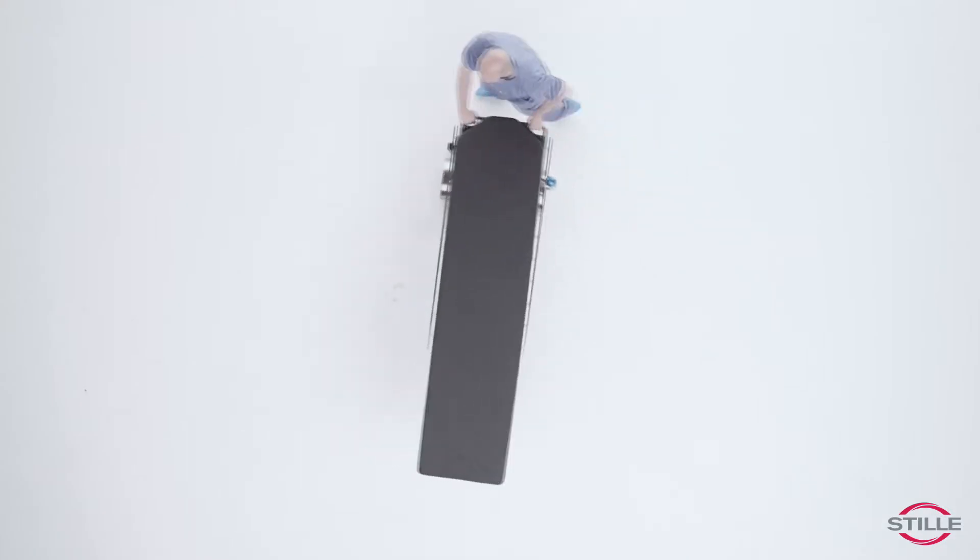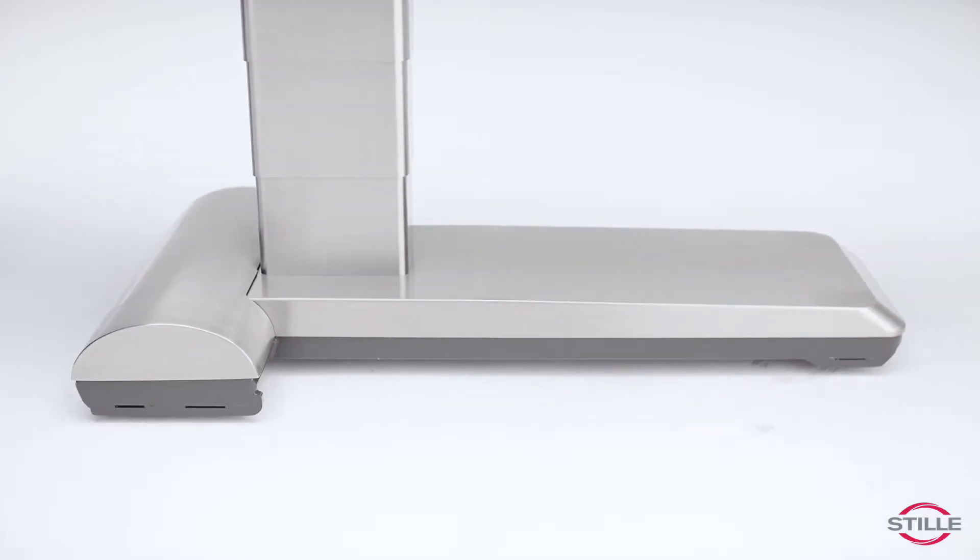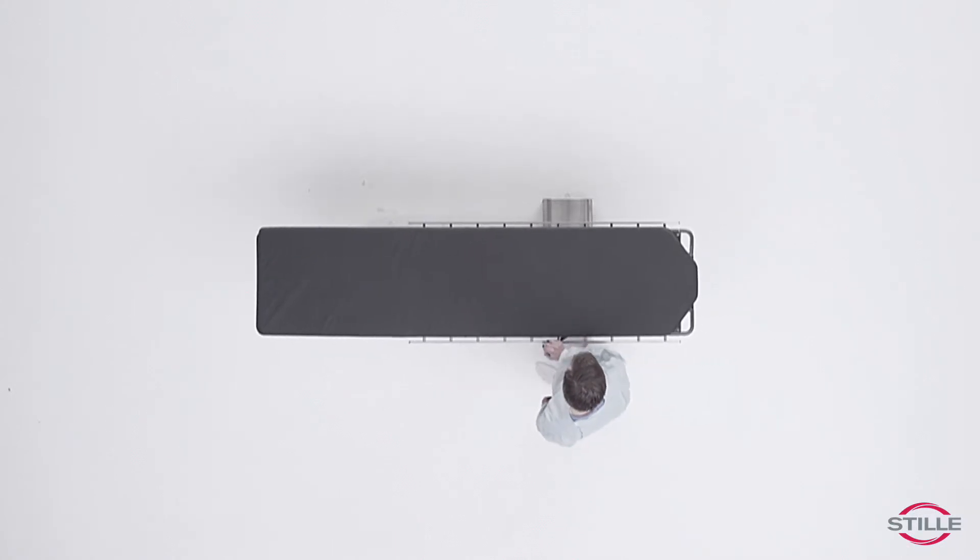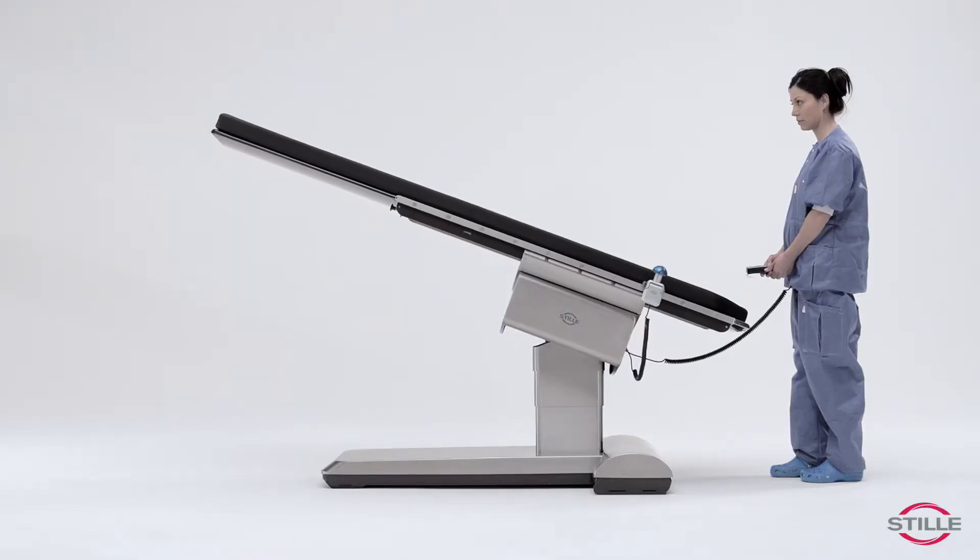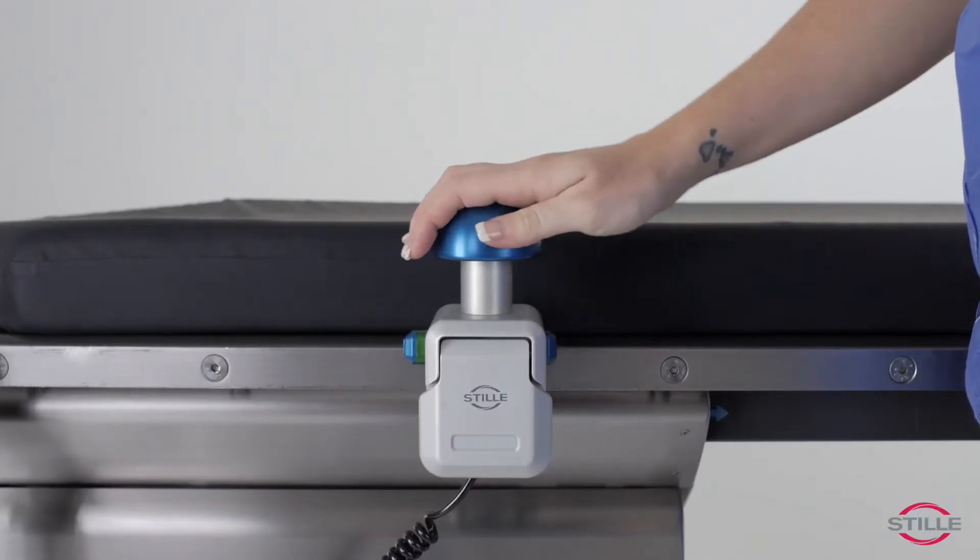The eMagic 2 is a mobile operation table with a free floating tabletop. All functions are maneuvered by the hand control or the pan handle.